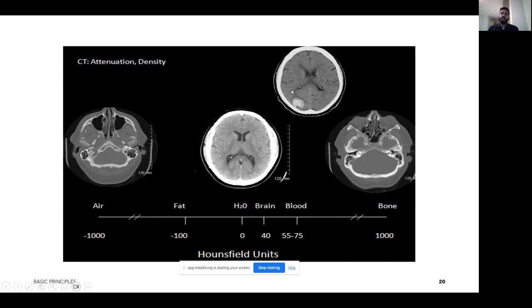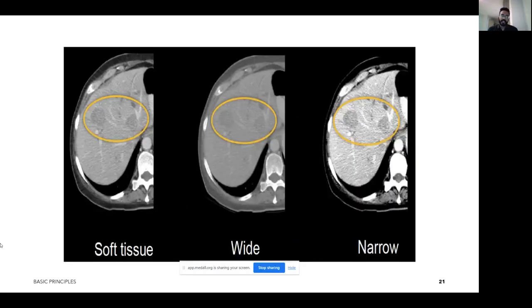Here, you can see that the soft tissue is not very clear, the contrast is not very good over there, and even the bone is not very clear, but you can start to pick up blood inside the parenchyma. Now this window is a very wide window where you are seeing air very well, but the rest of it is very obscured. So this adjustment basically helps you to focus on individual tissues to catch pathologies that you would otherwise miss with a wide range of grayscale.